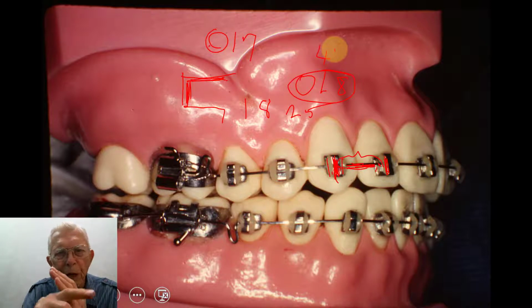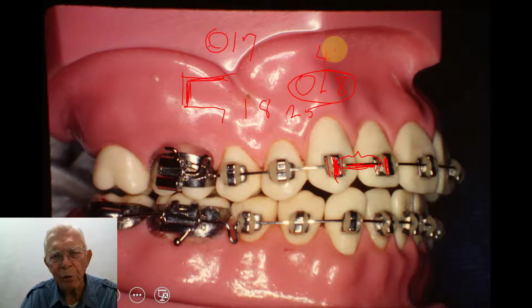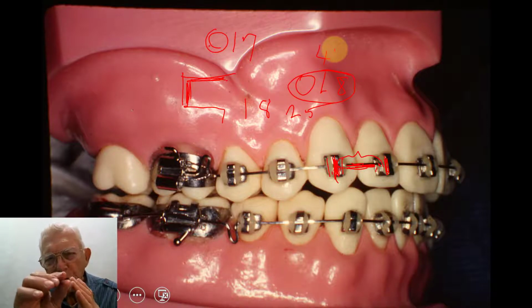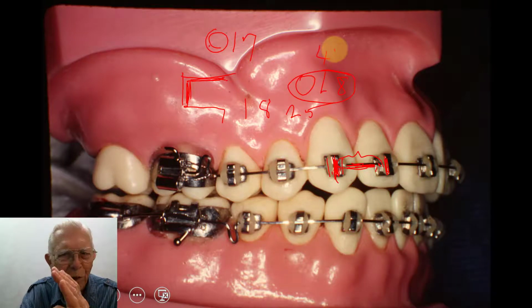So what I'm proposing, you give more torque to it and bring it up there where you want it, and then take it out of the tooth. Now I've graded cases for the International Association and also the American Orthodontics, people trying to pass the boards, and there are very few people who understand that. They think if I put the slot that's got the correct torque in it and bring it up there, it'll line up like that. But the closer you get to where it ought to be, the force from the wire to the tooth reduces and reduces and reduces, and when you get almost where you ought to be, it may take forever, it seems like.